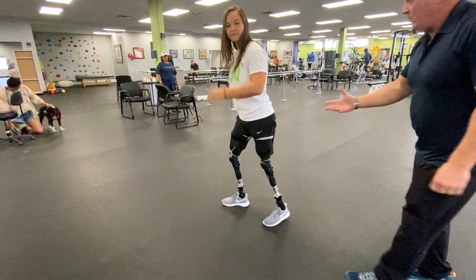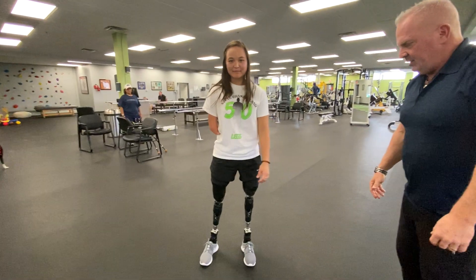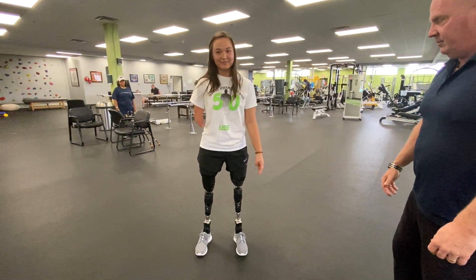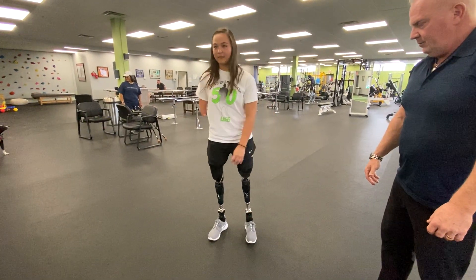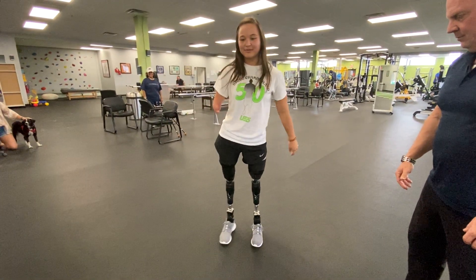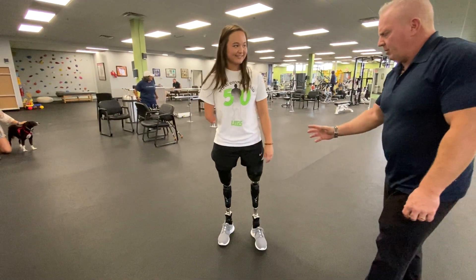So you want to kind of tell what it does, Ryan? It allows me to walk further distances because I'm able to actually utilize my muscles. My muscles don't get tired because I'm actually able to use them. When I'm walking, I feel like I'm almost on a running blade — like I'm getting pushed forward, so I'm able to have more energy return. Yeah, it gives you propulsion.